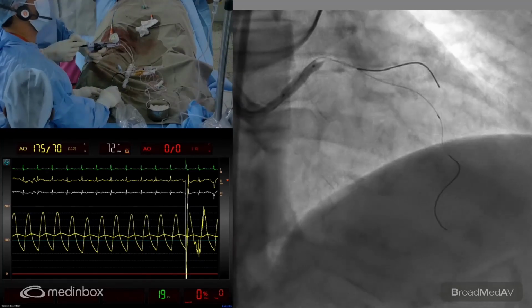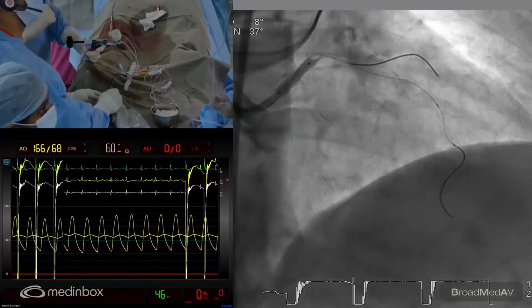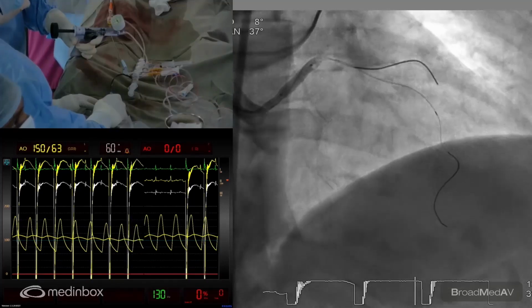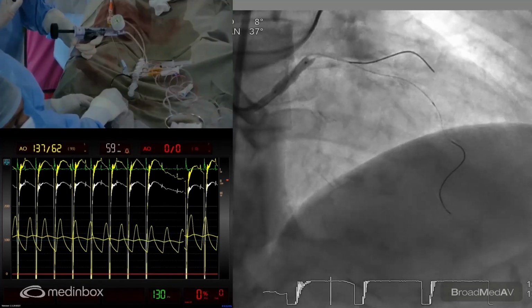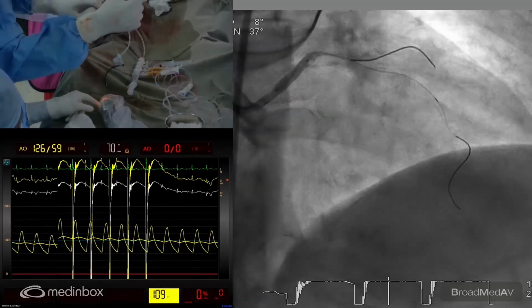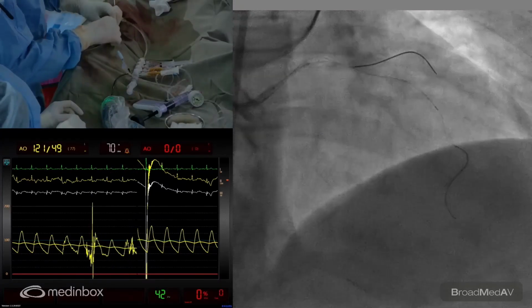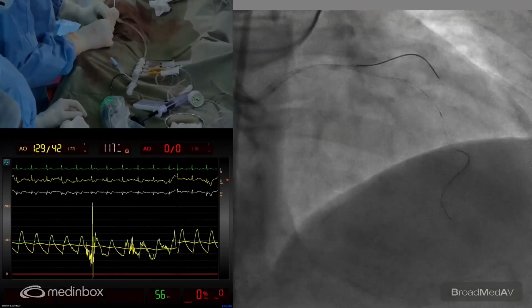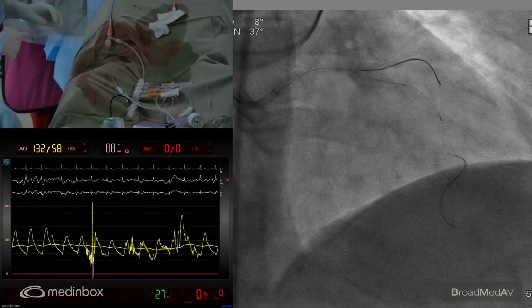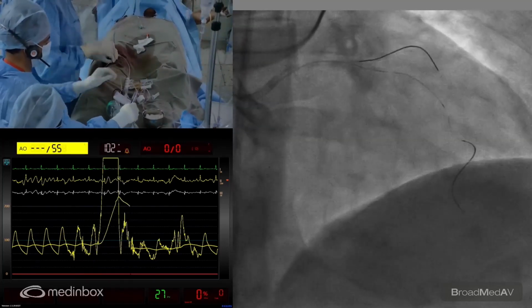So we are at 4 now. Okay, go ahead. Starting on. 1, 2, 3, 4, 5, 6, 7, 8, 9, 10. And these shockwave pulses are not capturing the heart. We can see clearly there is a dissociation between the shockwave pulses and the arterial pressure tracings. Deflate, sir. Okay, so we've done something with the IVL now. I'm letting the balloon deflate. The pressure came down, and I will just bring the balloon back. Let the pressure come up, and we'll do an IVUS now. Okay.